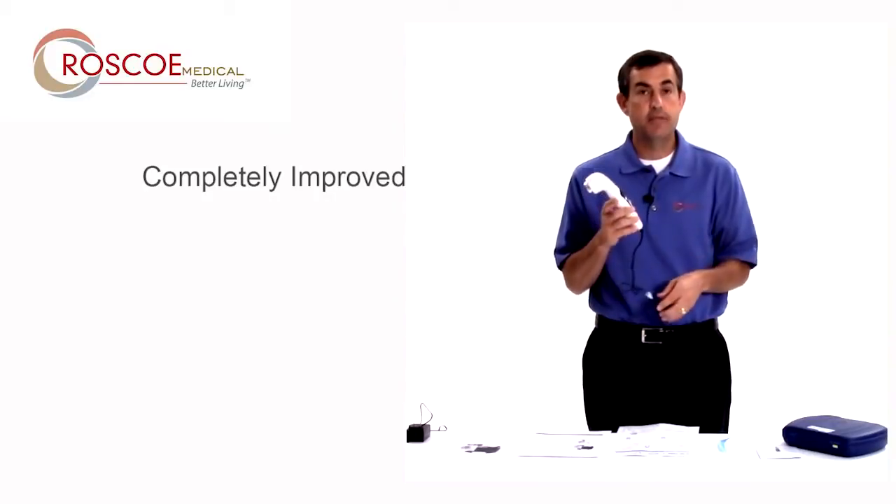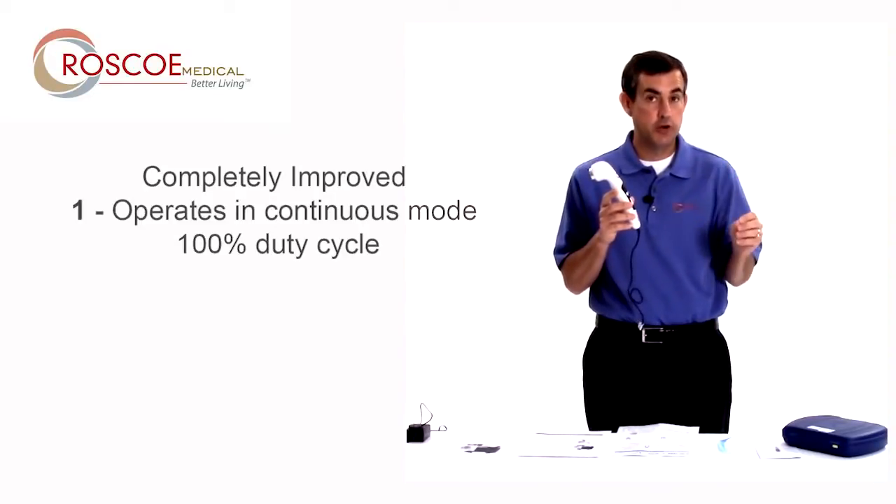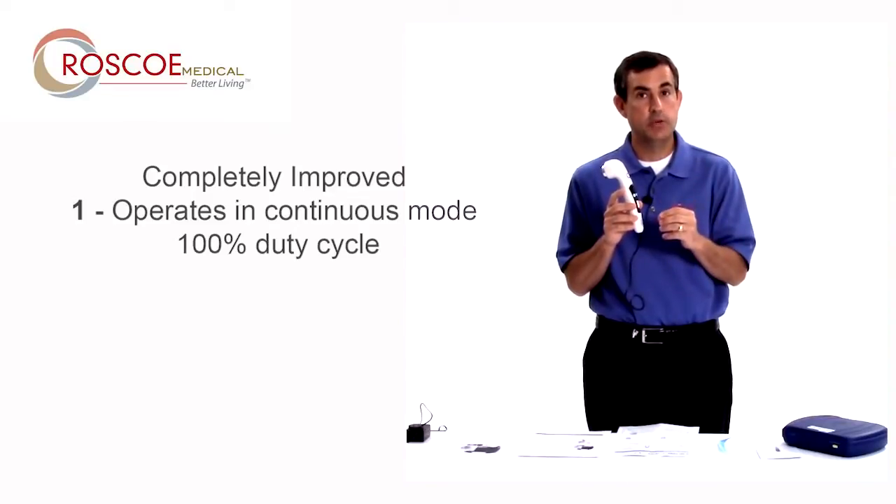The first difference is, instead of just operating in pulsed mode like the first edition did, the US Pro 2000 second edition can operate in continuous mode or 100% duty cycle. That's a big key difference.